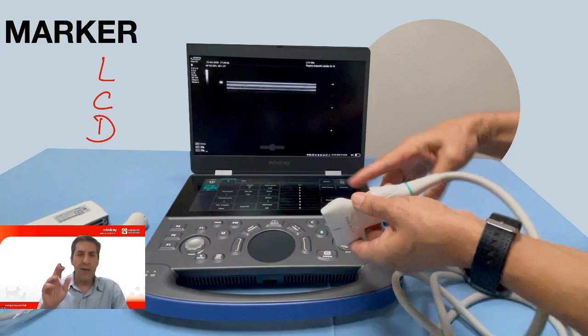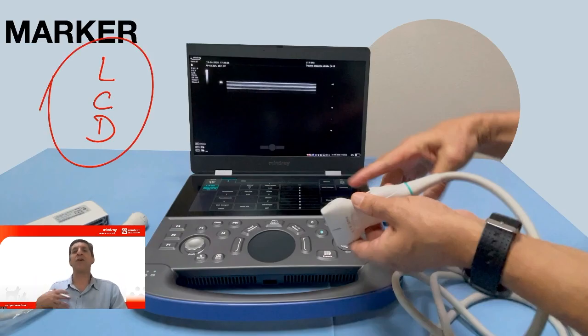Okay? We will specify this for every single block we are going to learn together. But keep in mind that one of the most important things, before touching the body of the animal with the probe, is to be aware of the position and orientation of the marker of the ultrasound.